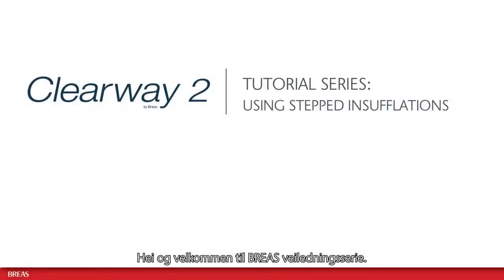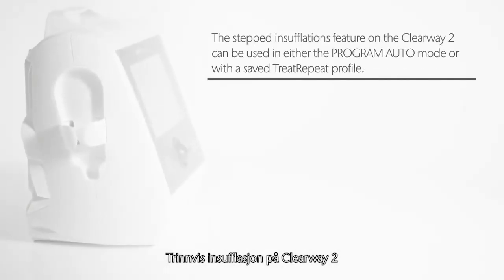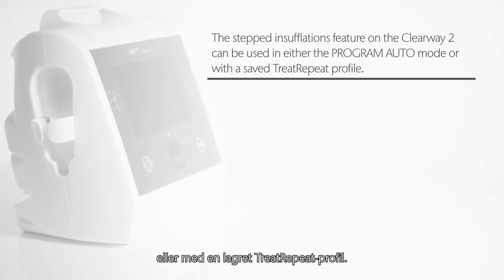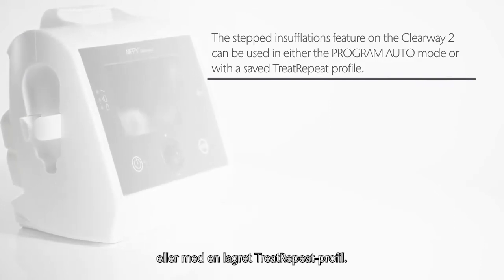Hello and welcome to the Breas tutorial series. In this video I will show you how to use the stepped insufflations feature on the Clearway 2. The stepped insufflations feature on the Clearway 2 can be used in either the program auto mode or with a saved treat repeat profile.